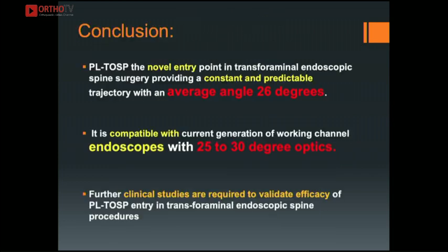So in conclusion, it is a novel entry point with a constant, predictable trajectory of average angle around 26 degrees, and it is also compatible with current generation endoscopes, ranging from 25 to 30 degree optics. But our study lacks clinical validation; clinical studies need to be done to validate the efficacy of PL-TOSP.